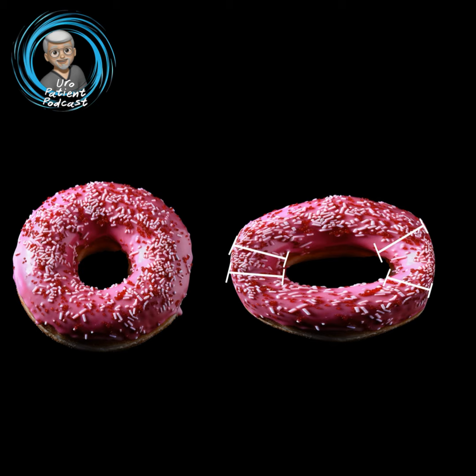Now, this is what it looks like. That's a Urolift instrument. So it's what we call a rigid cystoscope. It goes in through the penis, and that's how we're able to do the procedure. So it's a rigid instrument. You can check out episode 5, as I had mentioned, if you want to learn more about that. Now, this is from their website, from the Urolift company, and it shows what it kind of looks like, what it's doing.